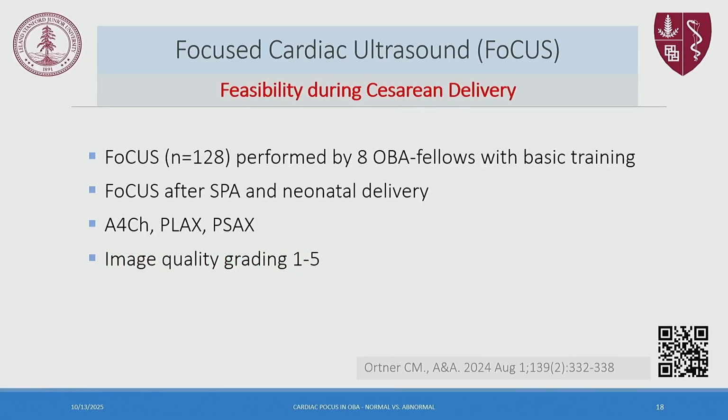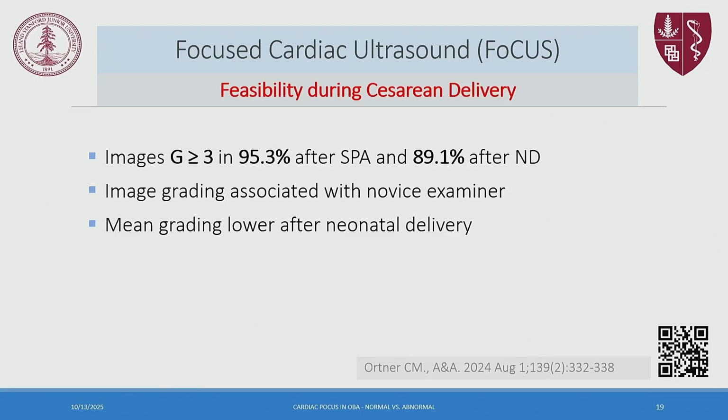So with our fellows, we actually studied whether you can do a focused cardiac ultrasound during C-section. We had 8 fellows, and we did a focused cardiac ultrasound right after the spinal anesthesia, and then after the neonatal delivery during C-section. We also graded these images. In 95% of our patients, we were able to get images sufficient for clinical decision making after the spinal, and after the delivery it's a little bit more difficult, but still almost 90% of our patients we were always able to get a good image.